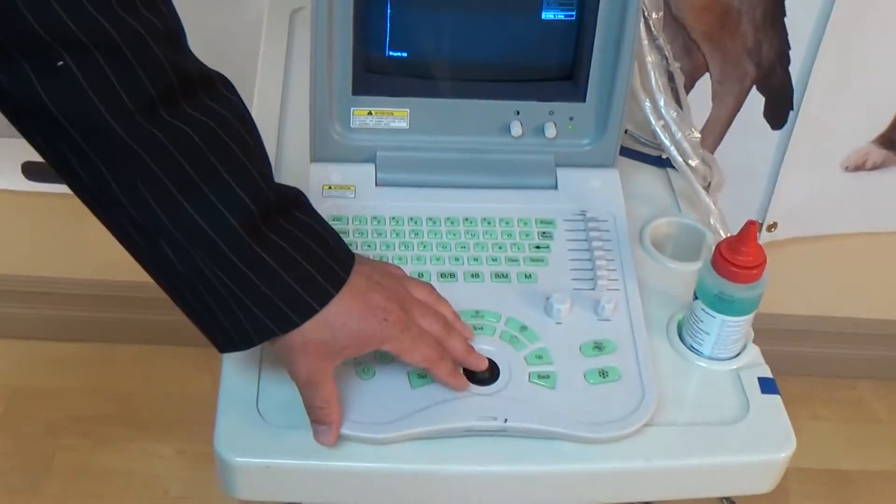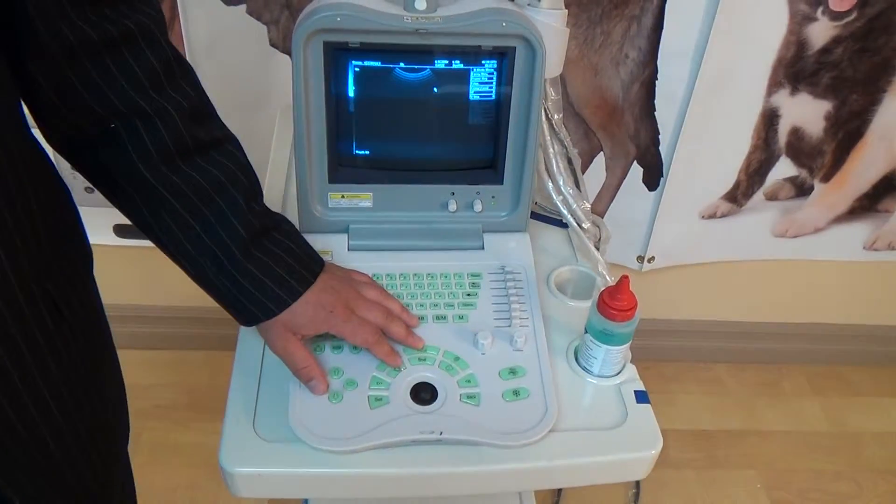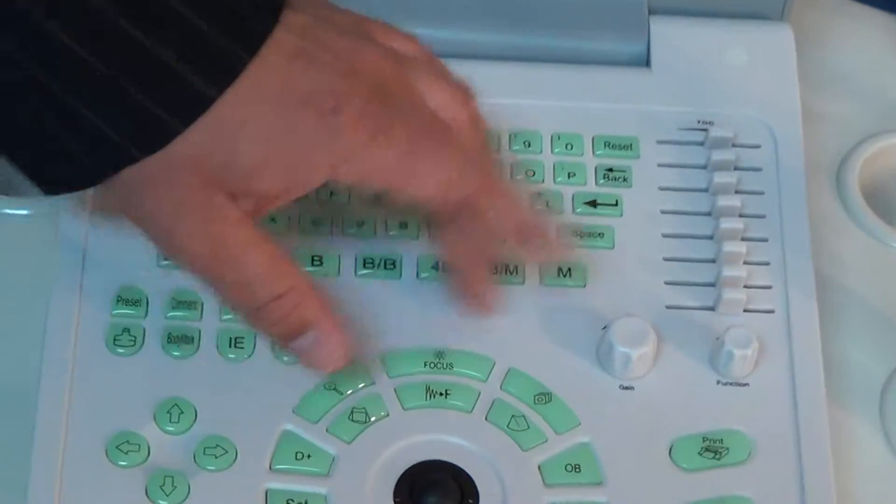The trackball controls our cursor — that's essentially the mouse of the machine. We're going to start in the middle, then go to the left, and then come back and finish the right side.